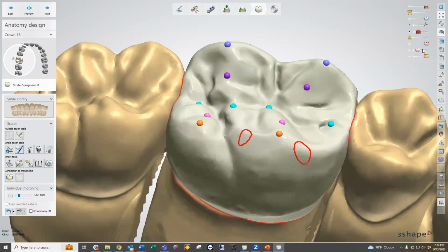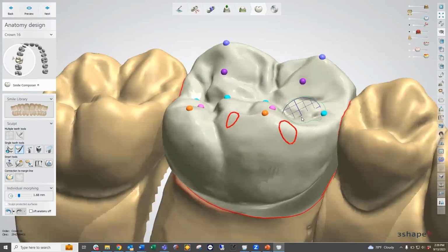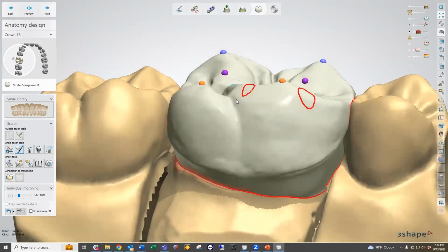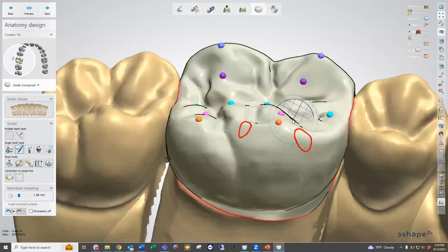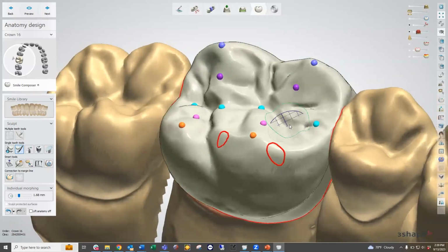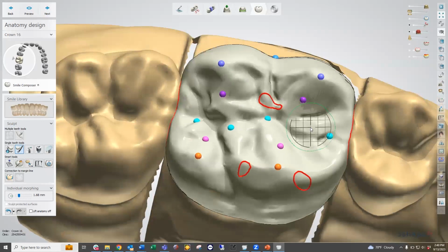And then finally, we have our options that we have for contacts. And these highlight areas where we're contacting either into our neighboring model, like on our interproximals over here, or contacting with the occlusion. And those are good to see so we can see relative areas that we're designing with and see if we're too high or too low in certain areas. Okay, so I could use my control key to go ahead and drag these areas up if I wanted to make more contact in these areas. I could do that. And that way we have nice functioning areas.